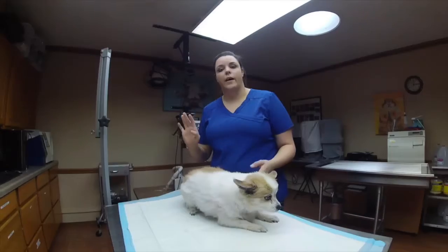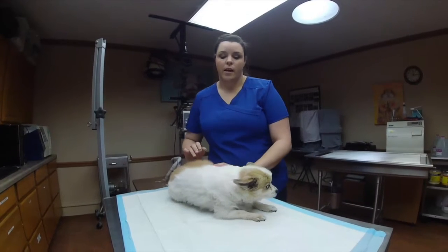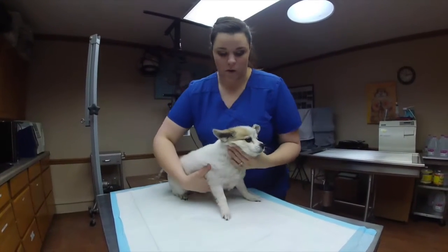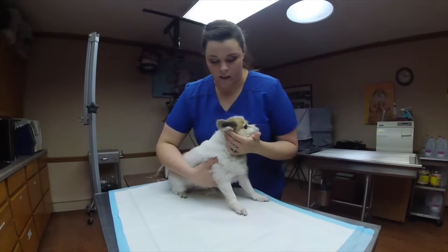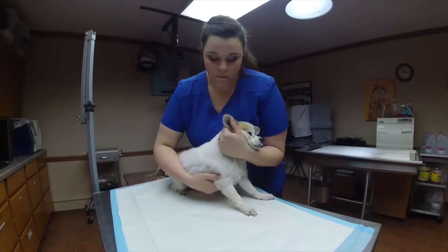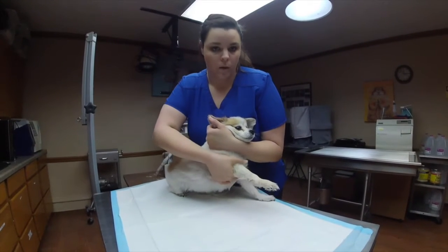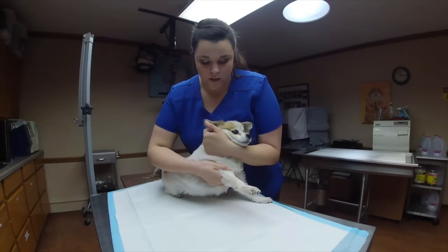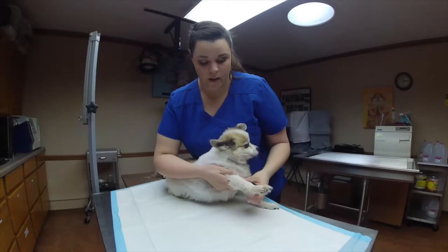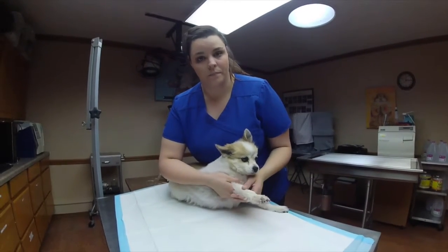wiggle around. How to draw a blood sample from the cephalic vein. That is your front legs here. You're going to hold their head over here, that way, in case you have an aggressive animal, they won't be able to bite. You hold their head here. You apply pressure underneath their elbow, put pressure on top of their leg and roll outward. That way you can see the vein and it's easier to draw on.